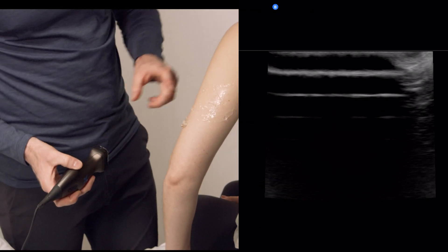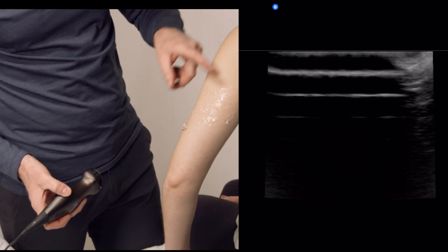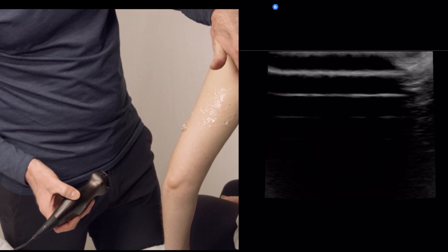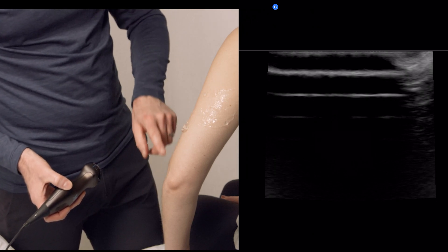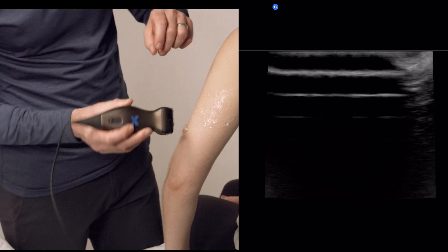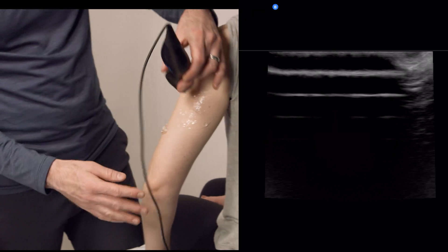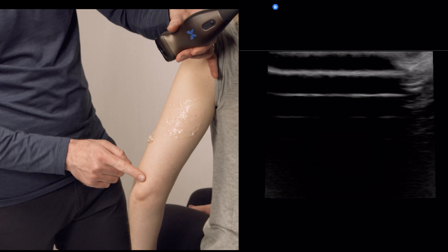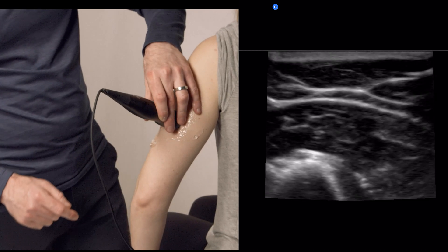We're going to look at the radial nerve. I've put some gel along here already, which marks the course of the radial nerve. It comes from the posterior humerus and wraps around the spiral groove, down into the anterior forearm, and lies just deep to the brachioradialis afterwards. The left side of the screen here is going to be anterior to start. The way to localize the radial nerve is to go along the lateral aspect of the humerus, along the middle of the humerus itself.